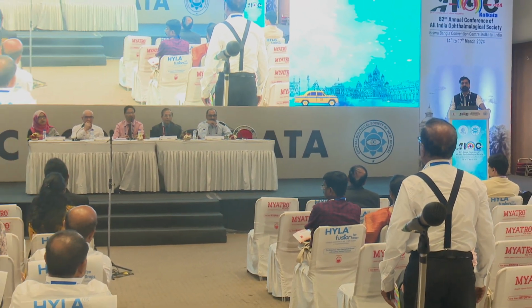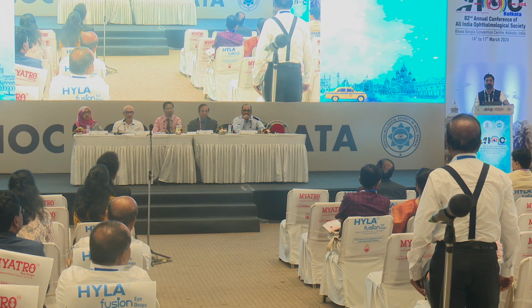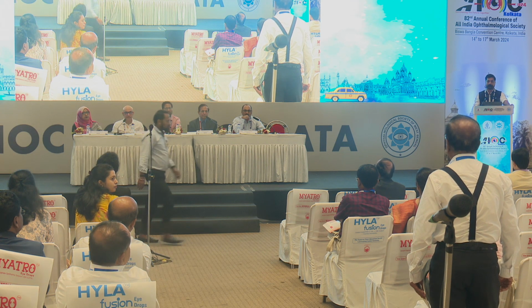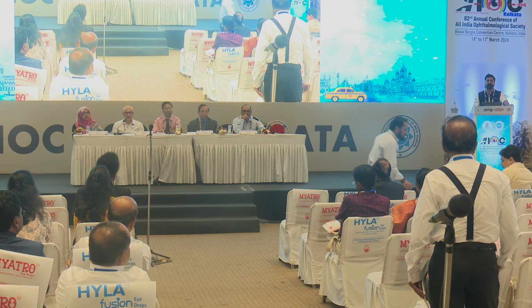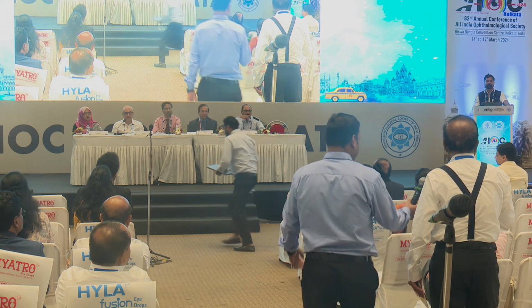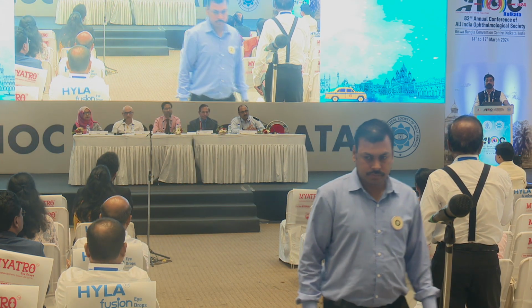Nobody explained about the intracameral use of adrenaline, and I think we are forgetting the subconjunctival use of gentamicin and dexamethasone at the end of every cataract surgery. Still, I think dexamethasone has a good role as far as inflammation is concerned, and with adrenaline, intraoperative miosis is prevented and bleeding is prevented. I'm using adrenaline in each and every case in the AC maintainer through that line.